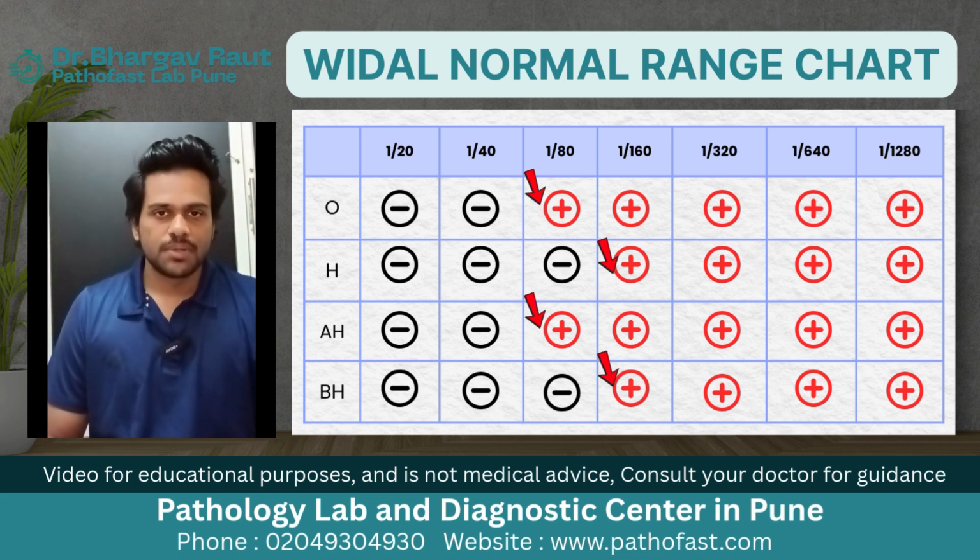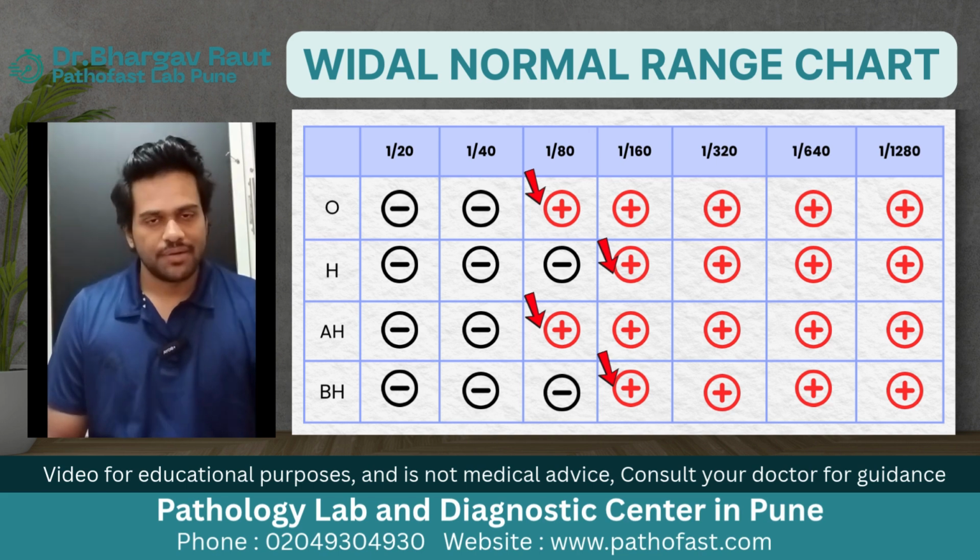So this is how you interpret the normal ranges of the Widal test or the typhoid test. And this has value because if we repeat your Widal test after 2 to 3 weeks and we find that the titers are even higher, we can be sure that you actually had a typhoid infection.